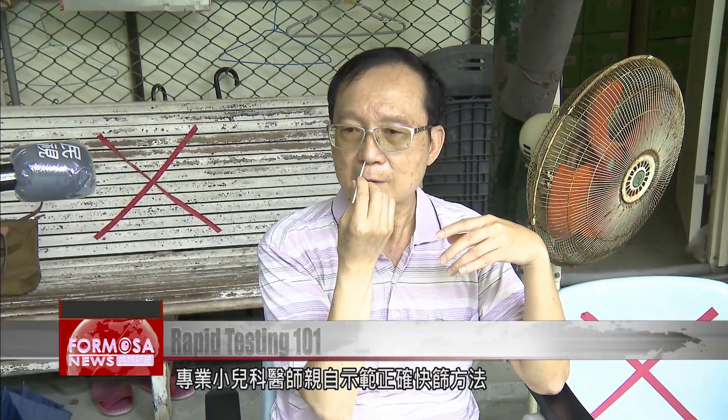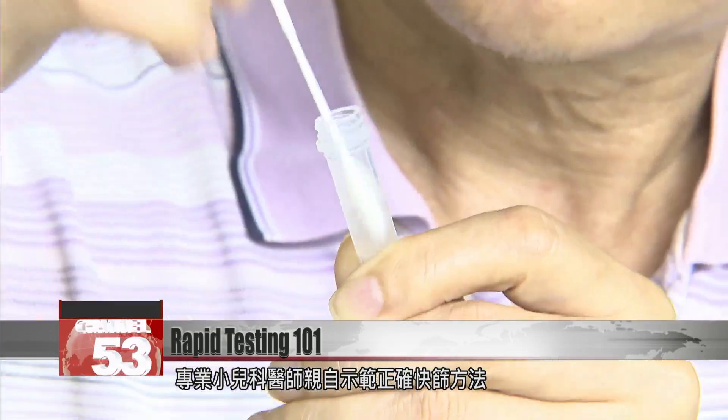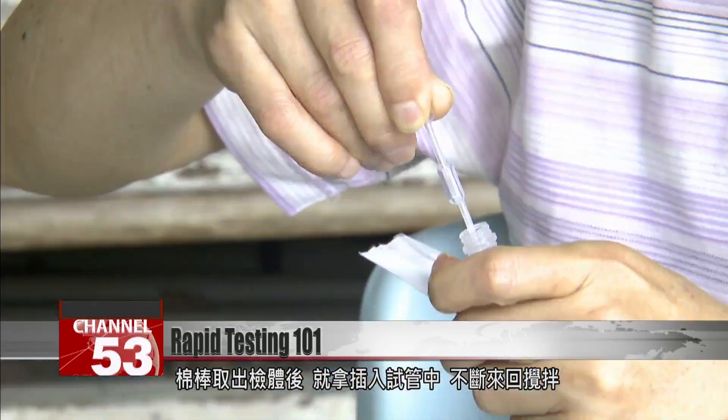This pediatrician demonstrates how to handle a sample once it's collected. Put the swab in the extraction tube and roll it around with the liquid. Then put three drops of the solution in the indicated spot on the test strip. You usually have to wait at least 10 or 15 minutes. At the beginning, the test is processing the sample, so it's not accurate unless you wait.